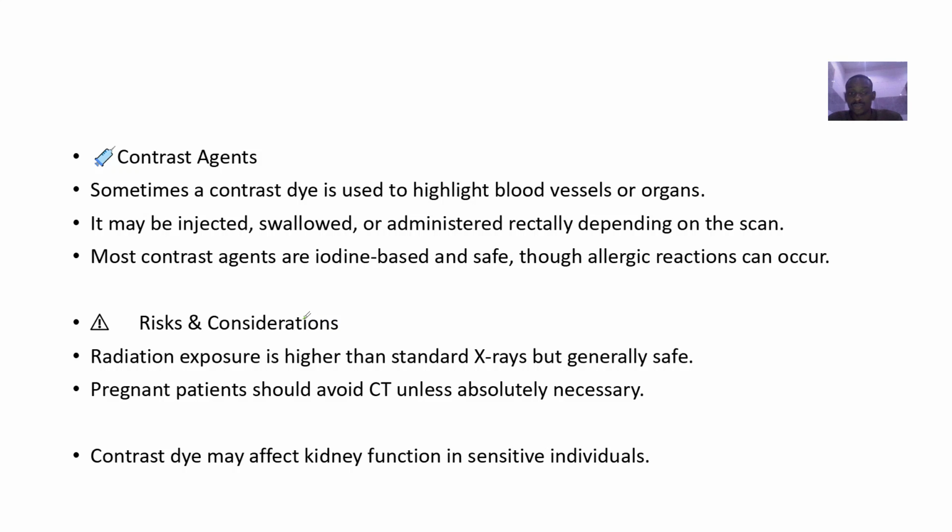Right? You can also use contrast imaging. So contrast imaging should basically what? Make images clearer. Inject the contrast directly into the organ, or you give it intravenously, that's what, through a blood vessel.